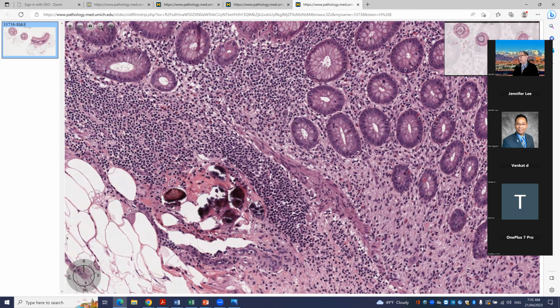What is in the structure of the shell that seemingly makes it less antigenic or doesn't provoke any sort of real giant cell reaction? All that we get is a little bit of fibrosis. I think this is a fascinating area of response. So are the parasites dead and then that's the reason why there's no response? Well, I don't think so.